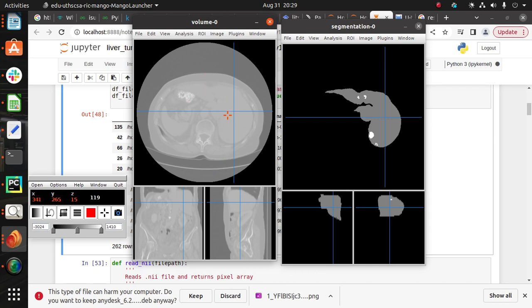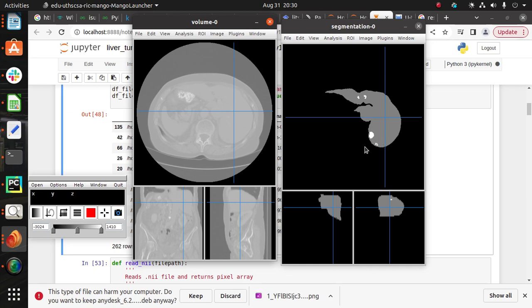But in the segmentation it is easy to show the liver and the tumor. In the segmentation image, here you can see the white dot - it is our tumor.